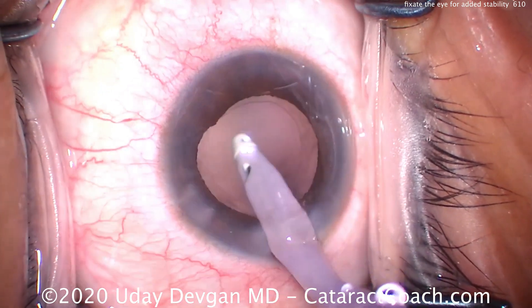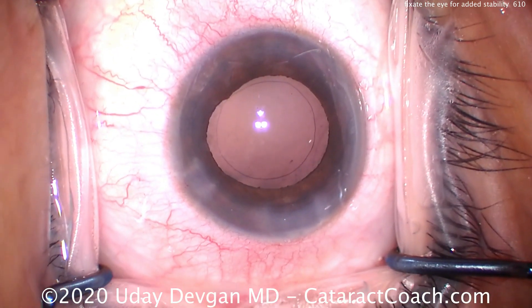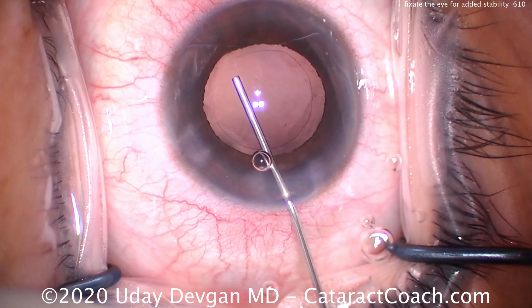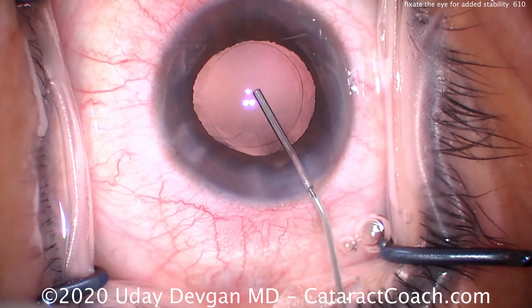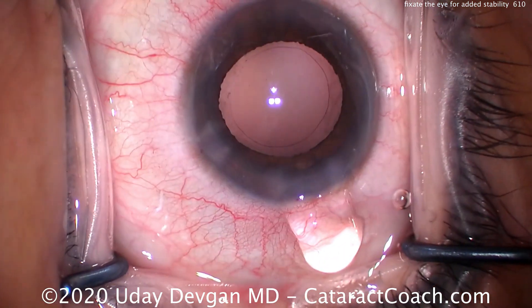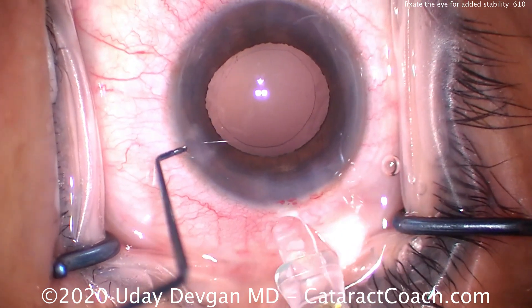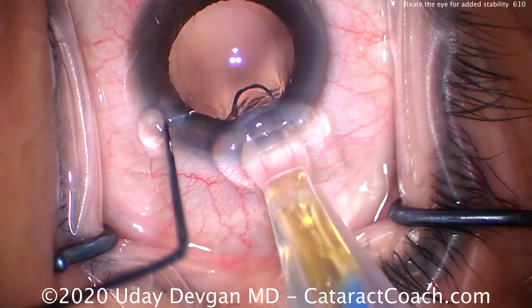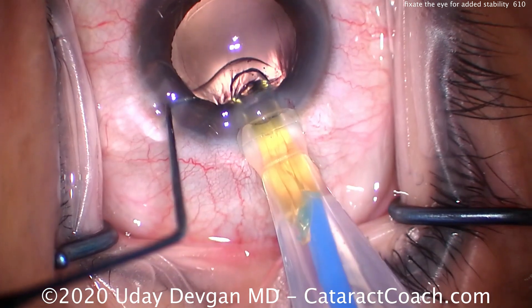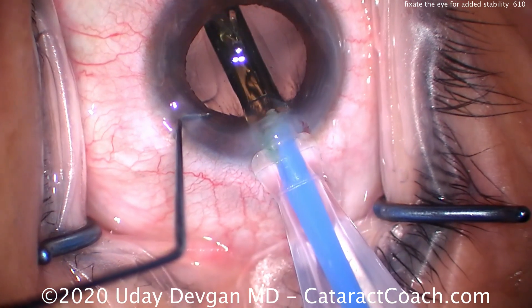The lens here is going to be a single-piece acrylic lens. We're going to put it right in the capsule bag, and that looks like a really nice capsule access too. Filling up the bag — again, be very careful. When you inject this, a sudden movement here could cause that cannula to go right through the capsule. A nice strong fill of viscoelastics — there's plenty there. Fixating the eye, keeping the injector tip going, nice and easy, nice and controlled. Get that lens carefully in the capsule bag.